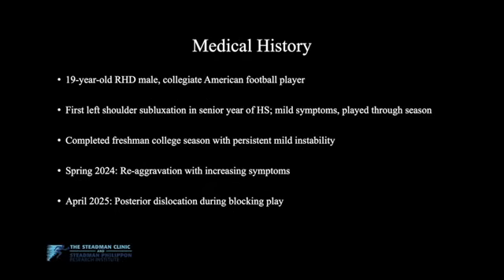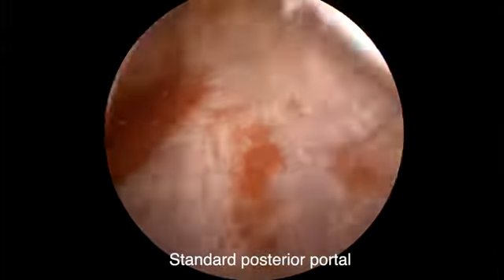Patient is placed in the beach chair position and examination under anesthesia demonstrates a grade 3 posterior load and shift without spontaneous reduction. Diagnostic arthroscopy demonstrated an anterior labral tear and a posterior bony Bankart lesion with glenolabral articular disruption.